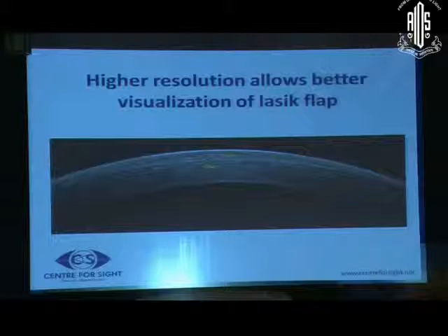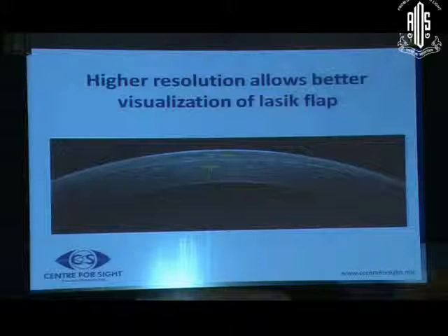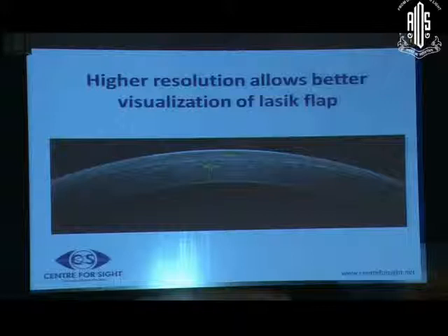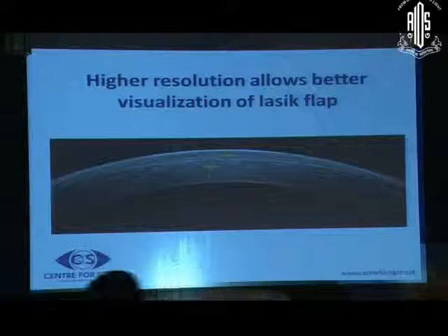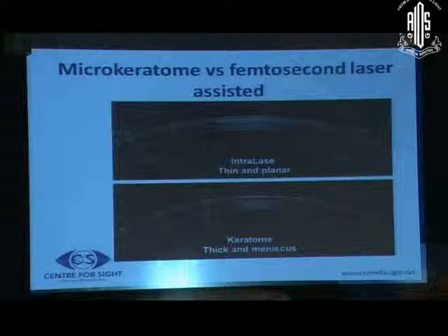In refractive practice, it is very important to visualize whether the flaps created during LASIK or femtolaser procedures are of desired thickness. Anterior segment OCT measurement allows us to measure thickness along the entire range of the flap. These scans show that flaps created with the femtolaser are more uniform and thinner compared to flaps created with the microkeratome, which are thicker and meniscus-shaped.